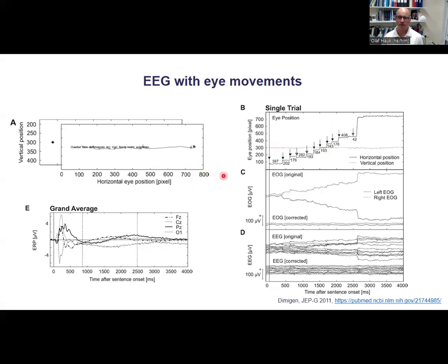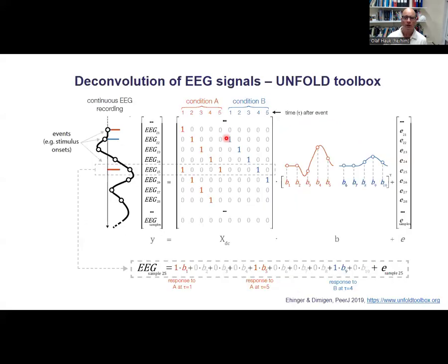So you need to include a number of confounds and covariates, and on top of that, you have artifacts in your data, but that's something we dealt with in another session. For this, you also have at least one toolbox now that works with a large-scale regression model that gets you these brain responses for different parametric modulators, let's say word length, word frequency, what have you.